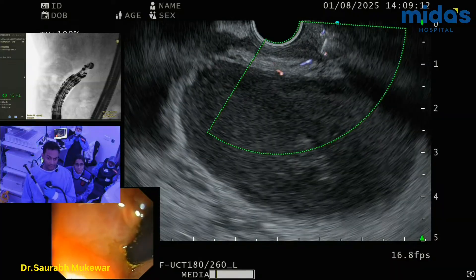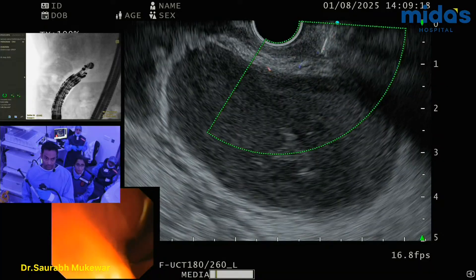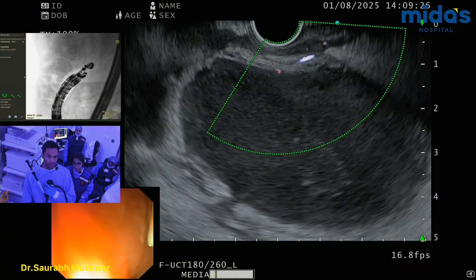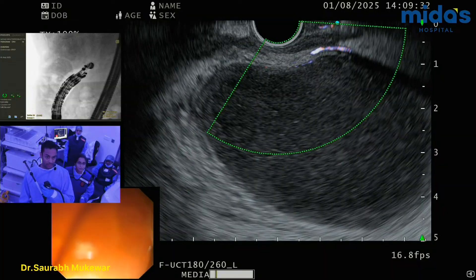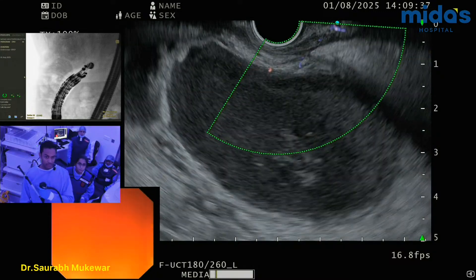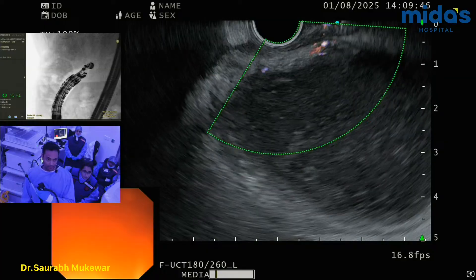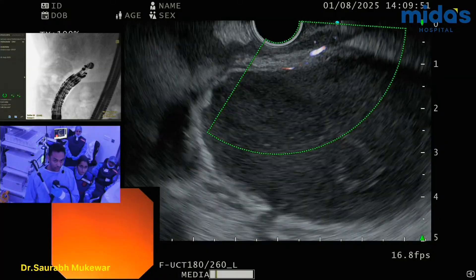Maybe here. Let's see. I think the exercise is obviously to find that perfect spot. Pull it up and see. Because you don't want to squish the vessel and then assume there's no vessel, but there is a vessel here. So this vessel I have to avoid. I'm going to push the scope to be in a more stable position. If you're unstable, it's a mess — suddenly you put the stent and your scope's away and you can cause a big problem. So stability is very, very important. I can go across a small vessel, but if it's a more stable position, I'll choose that.